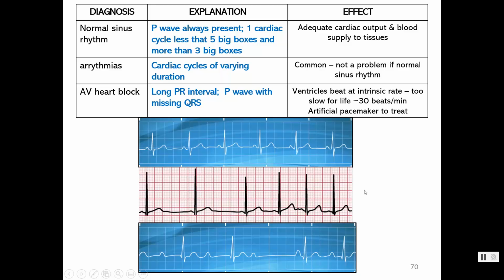There's certain pathologies where if you have so many runs in a row and it looks a particular pattern, that could mean pathology, but for the most part, sinus arrhythmia is not a clinical issue. A lot of people have arrhythmias due to too much caffeine, not enough sleep, or stress. So little runs of arrhythmia usually are not a problem.